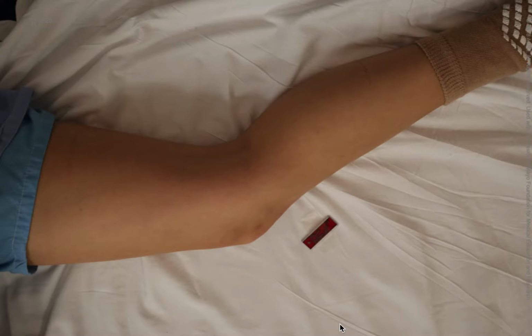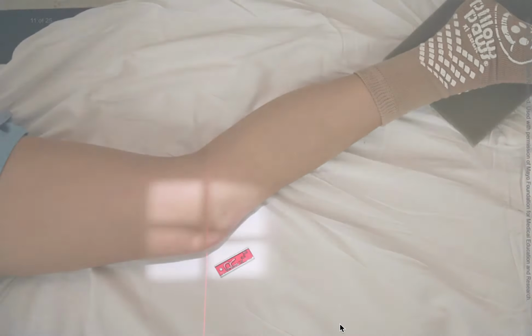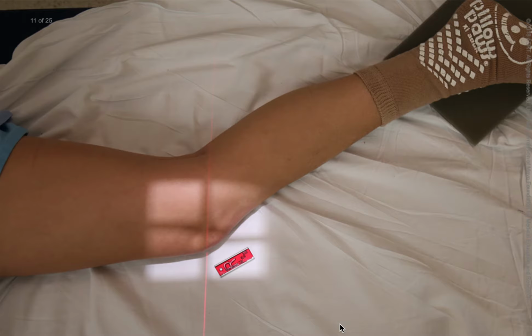Adjust the patient's body position until the patella is perpendicular to the plane of the image receptor, and make sure the femoral epicondyles are superimposed. The central ray is directed perpendicularly and enters at the midpoint of the patellofemoral joint. Anatomical markers are placed on the image receptor to identify the anatomical side that is being examined.